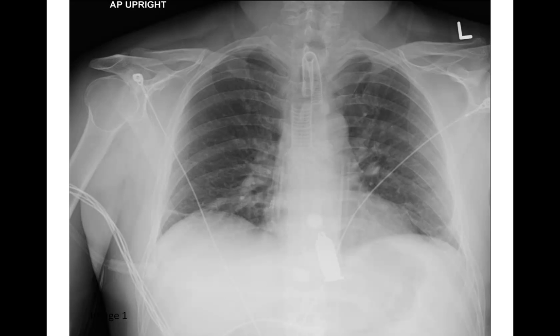So we go to this patient's chest film. This patient does have a tracheostomy tube in place. That was one of the questions. This patient also has something else that's abnormal in the airway, and that is a stent. The stent is there to keep those large airways from collapsing. This patient had tracheomalacia. The cartilage rings have been softened. When he forces an exhale, actively blows, he's going to close that major airway down, so you're going to generate collapse.